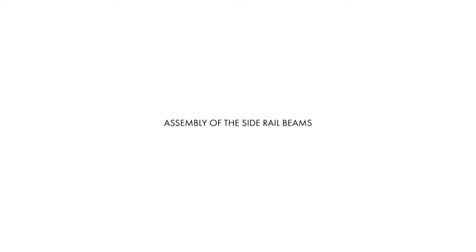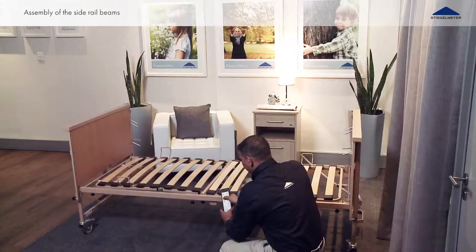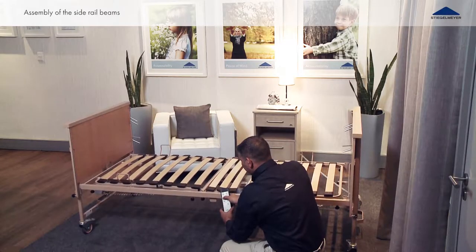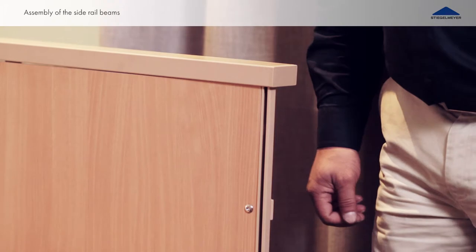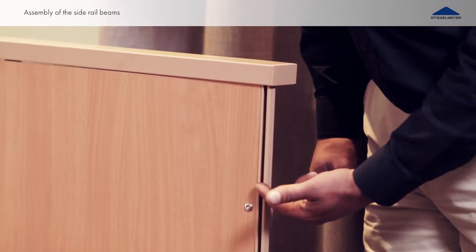To mount the side rails, the reclining surface frame must be set to the middle position. You will find a guide bar for the side rails on the left and right side of the end boards.